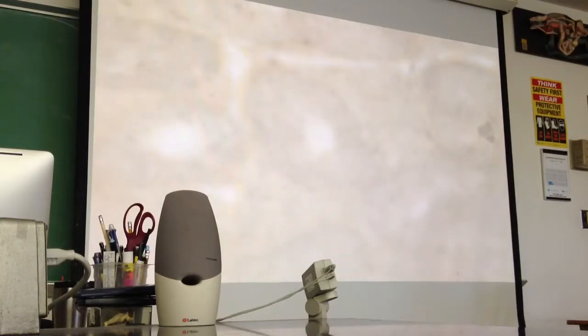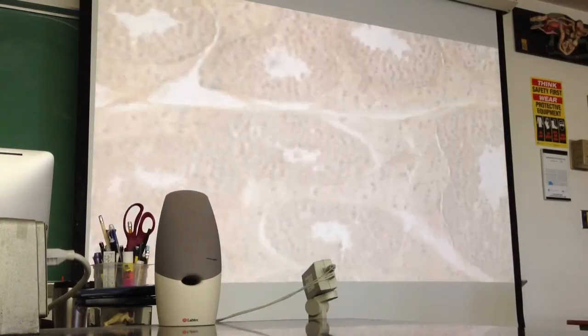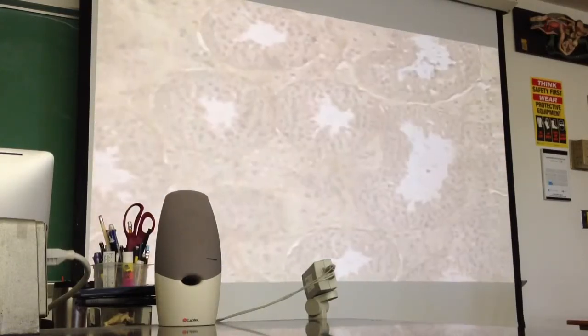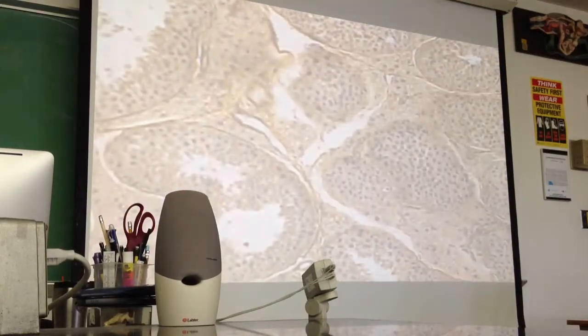In other anatomy classes, like the one I had to take, we had to tell cell differentiation between the layers within the seminiferous tubule. So this is kind of just form and function knowledge that I'm going to be giving you, not something that's needed for the exam, but since you're my captive audience, I mentioned that. I just want to find a good one.